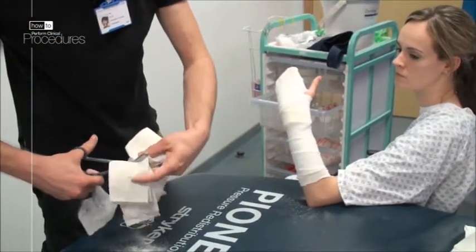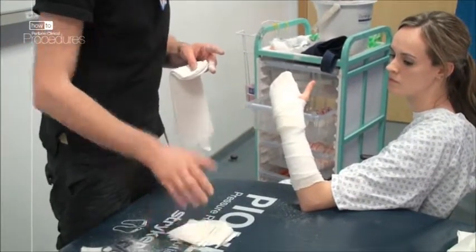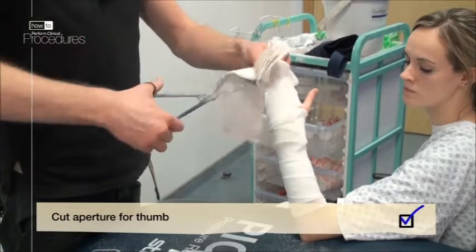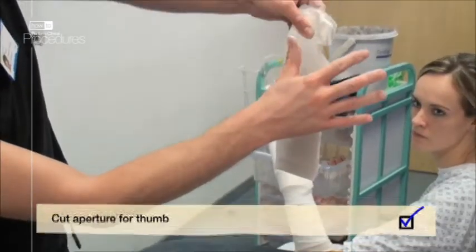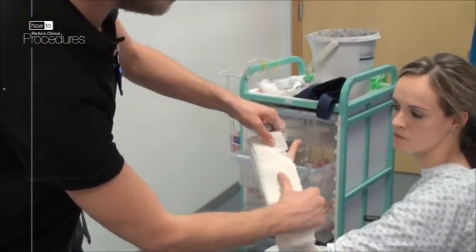Cut the plaster to length and save the offcuts to fix the crepe bandage once finished — you will see this later. Cut a semicircle out of what is your intended lateral edge of the plaster to accommodate the thumb. A full rotatory thumb movement is desirable to avoid stiffness.